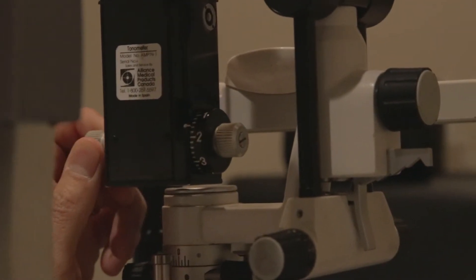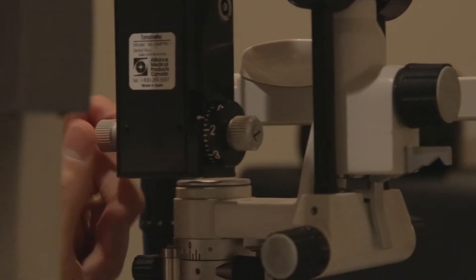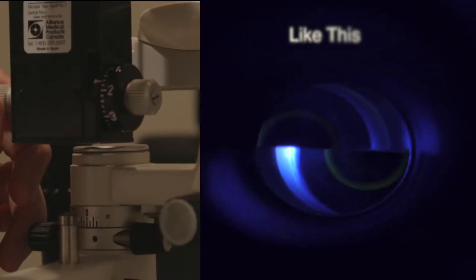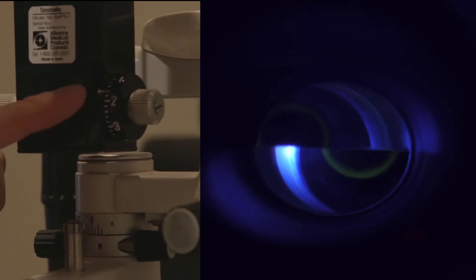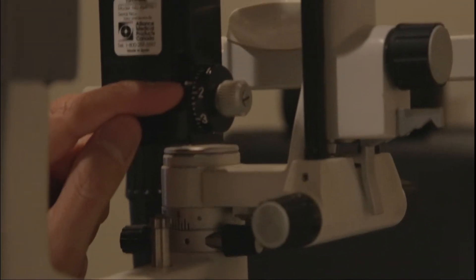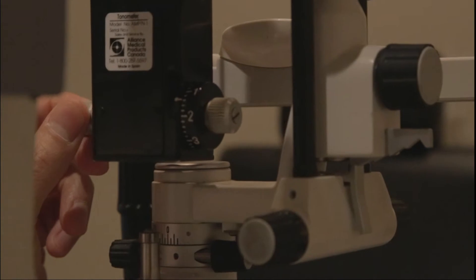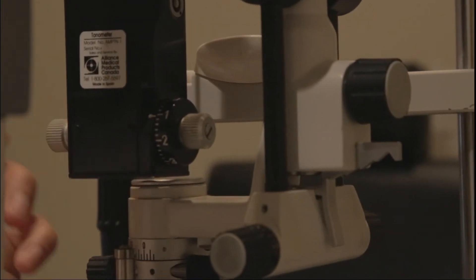This is the gauge for the Goldman tonometer. As you turn the dial, the semicircles you see on the cornea will move further apart or closer together. When the inner edges of the two semicircles touch, you've reached your endpoint. For example, if the dial reads 1.6, multiply by 10 — the pressure is 16 mmHg. Similarly, a reading of 2.0 gives 20 mmHg, and if the endpoint is at 1.0, the pressure is 10 mmHg.